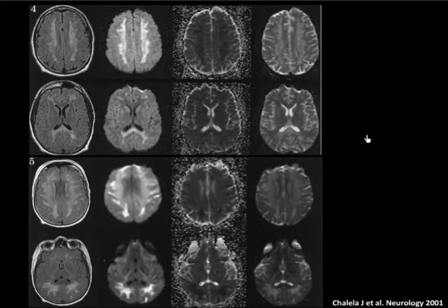And this is the imaging correlate of what Julio found, and you can see extensive diffusion hyperintense lesions involving here the centrum semiovale, here the corpus callosum, and here again in these subcortical white matter structures with the corresponding ADC map. So you can see here FLAIR, diffusion-weighted imaging, ADC map, and this is a T2 sequence.